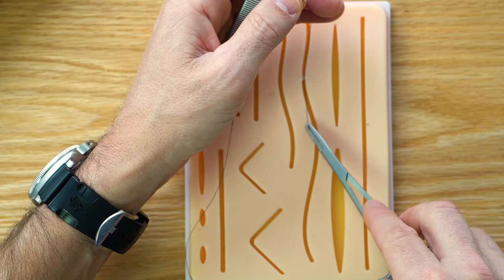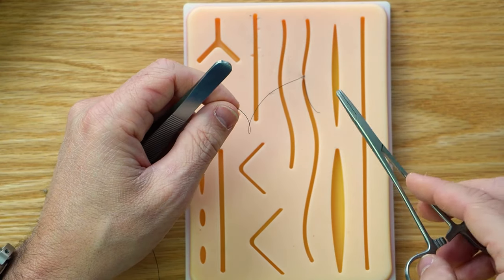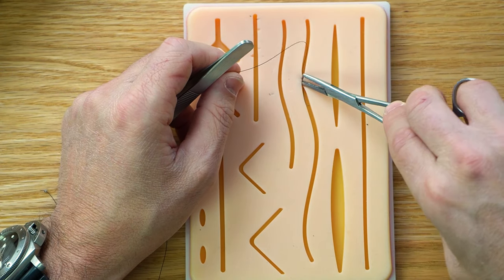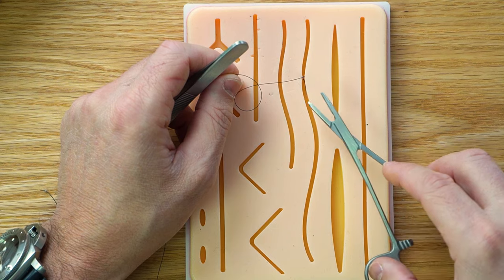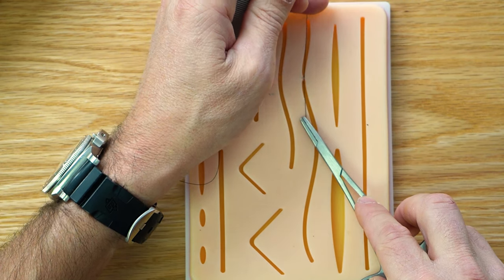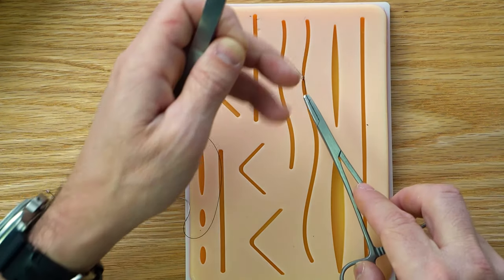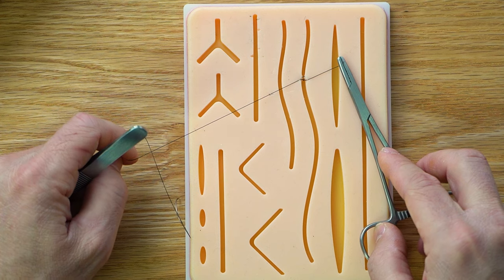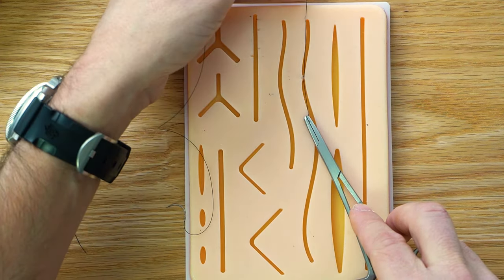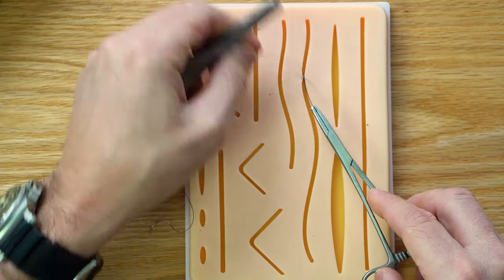Most of the time I use, like I said, Vicryl, which is a polyfilament, so I just use one knot. You can do two throws at the beginning, that's okay. Actually, let me just take this out for a second to demonstrate something. What I do is I pull this, and then I pull lengthwise along the length of the incision. I don't pull this way to get that knot to come down. That's very important. If you pull this way, you're spreading the incision open while you're trying to pull the knot down. So if you pull this way, it comes together much better. And then just do a couple more, depending on the suture material.